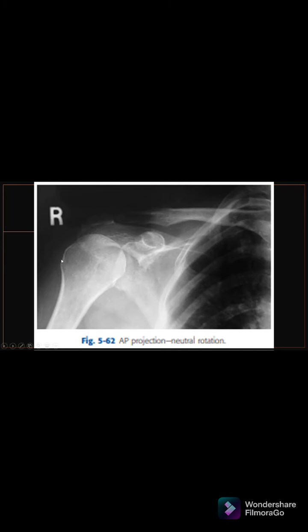So kaya ito siya trauma position kasi you don't need the patient to move the hand or hindi na kailangan i-rotate. Pero disadvantage din sa radiologist, mahirapan siya i-identify, lalo na kung may fracture, mas mahirap i-identify ang mga tubercles sa isa't isa.